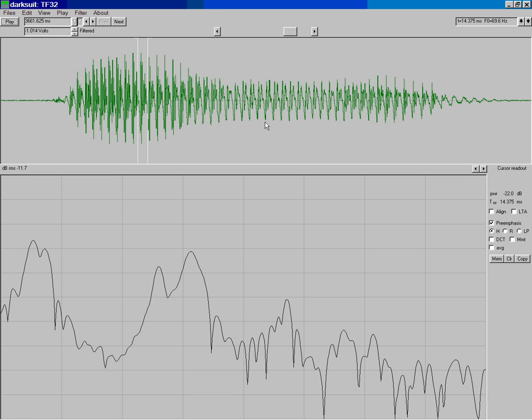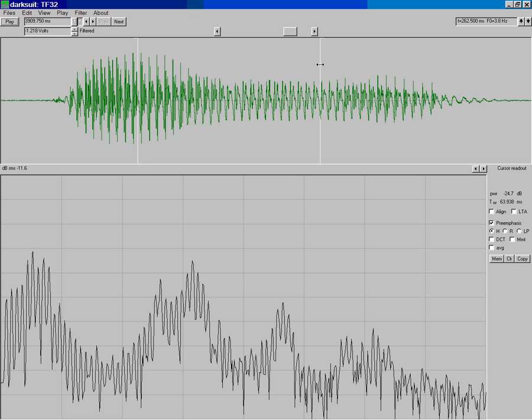The bottom line is that then it gives you a not as representative view and not as you would expect. And the simple way to solve this problem is to either get rid of the right cursor or slide it far enough away from the left cursor so that the program is allowed to do the analysis over the time window that you expect.